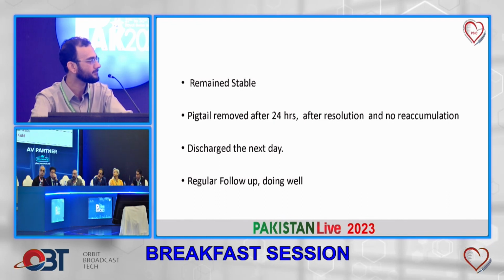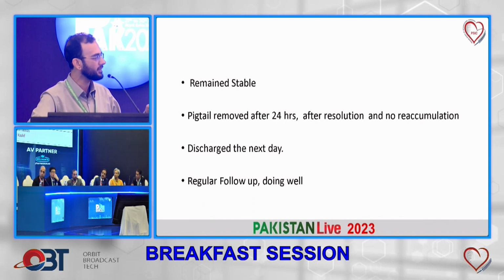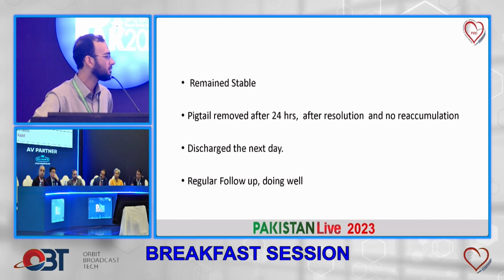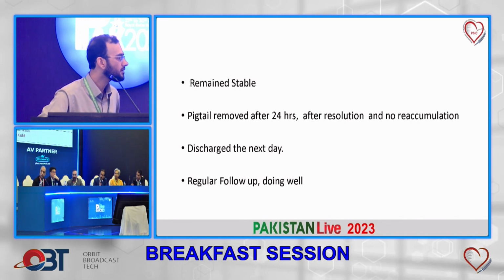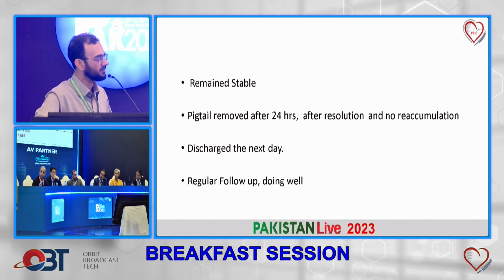Mashallah. And when you were doing the case, did you do an echocardiogram when you had that perforation? Yes, we did repeated echocardiograms on the table. While we were doing balloon tamponade, the echocardiography team was there. Once you had everything secured and you were about to shift the patient, you did an echocardiogram? Yes, we did. You must have had some rim at that moment. Yes, we had trace pericardial effusion.